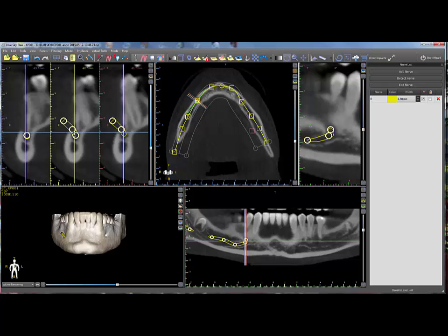If necessary, the nerve position can be adjusted by left dragging any of the thick circular control points in any of the 2D views. Repeat the same procedure for the opposite nerve.